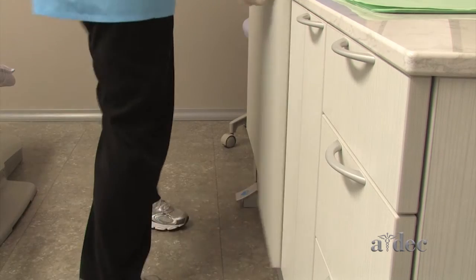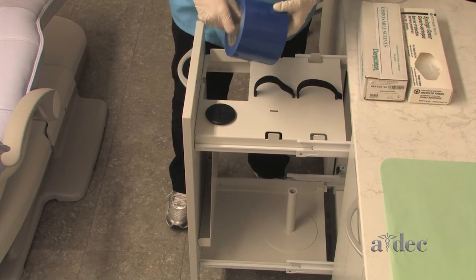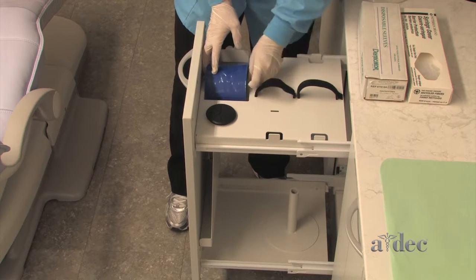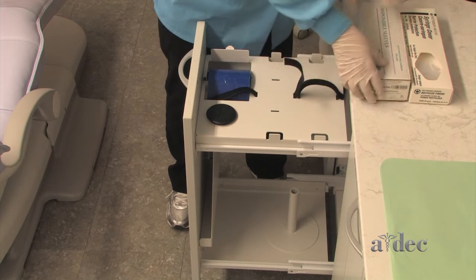The barriers drawer is designed to hold all of your barriers. The sheet dispenser works like a bath tissue holder. Velcro straps hold boxes of instrument sleeves.